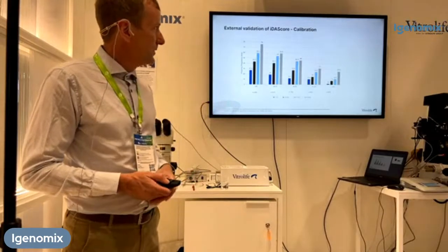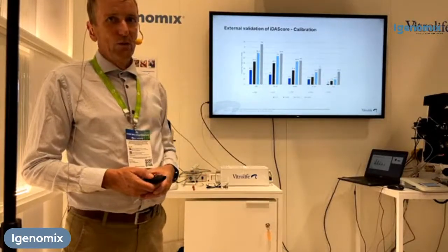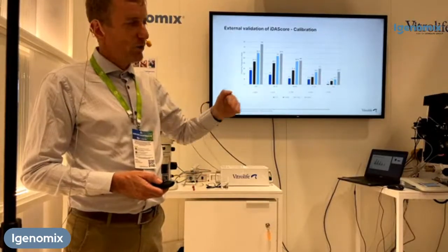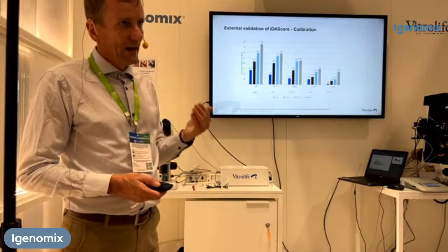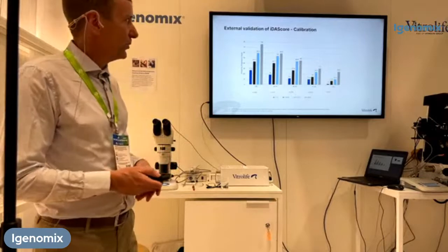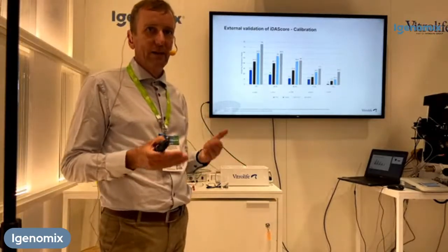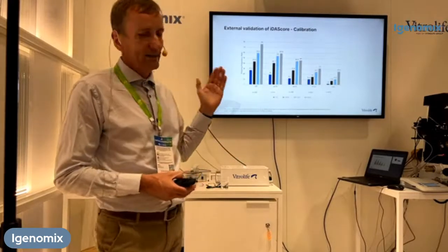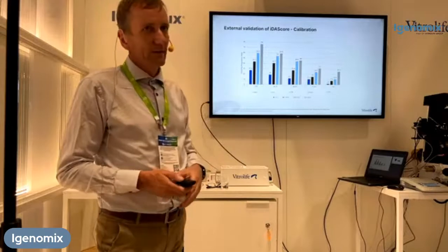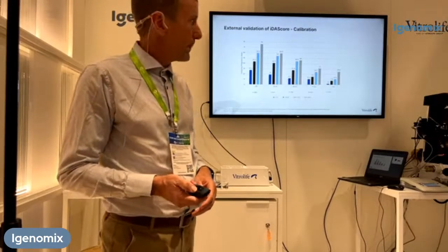Of course, the implantation rate goes down with age groups, so it's not like it predicts the actual implantation, but that's also why we have chosen to use a scale from 1 to 9.9. We don't want to predict the actual implantation, we want to rank the embryos, but also see that you have a good correlation with implantation likelihood.